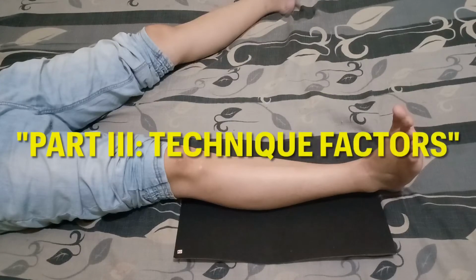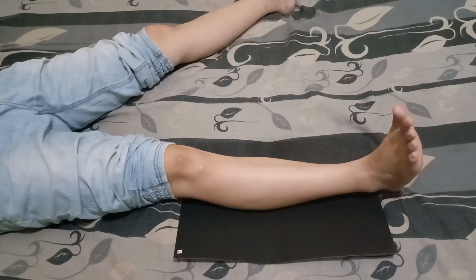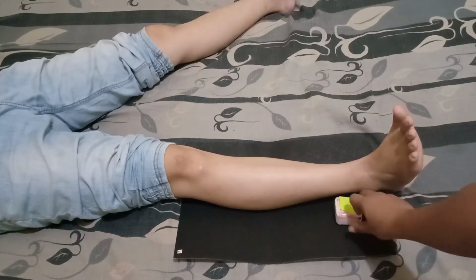For part 3, it's the technique factors. The placement of the marker should be at the right leg of the patient since the affected side of the patient is the right. Just like this.